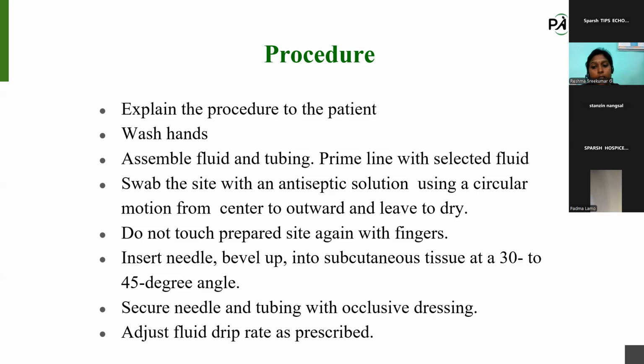From this interstitium, the fluid is absorbed into the bloodstream and the lymphatic vessels, and from these capillaries, the fluid directly enters into the systemic circulation. This is the process of absorption happening in subcutaneous infusion.